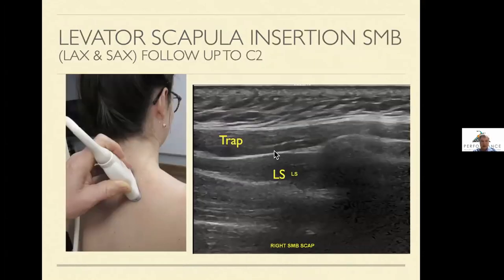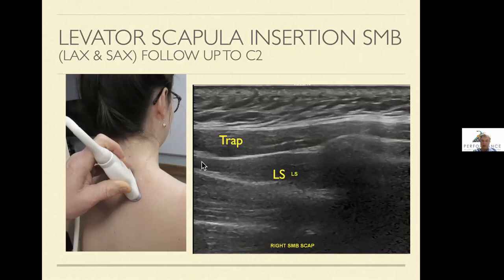Once you've completed the windshield wiper, I'll switch to a long axis view. At the superior medial border, I'll slide my transducer up and slowly dial it toward the C2-C3 area to get true long axis to levator scap. By doing that, you'll be able to evaluate this much better in terms of the entirety and functionality. This takes practice a few times but is well worth learning, because frequently you'll pick up pathology here that you weren't aware of on the short axis version.